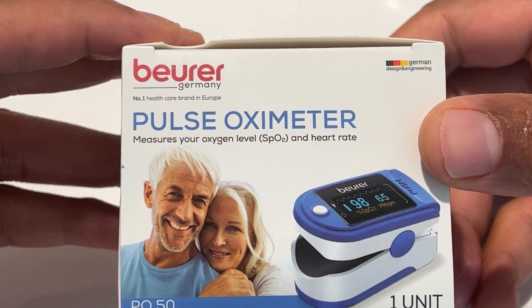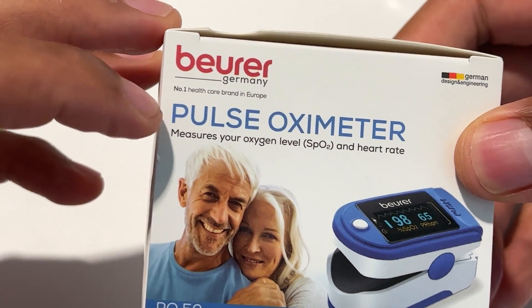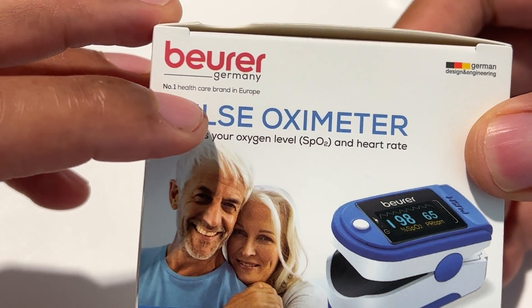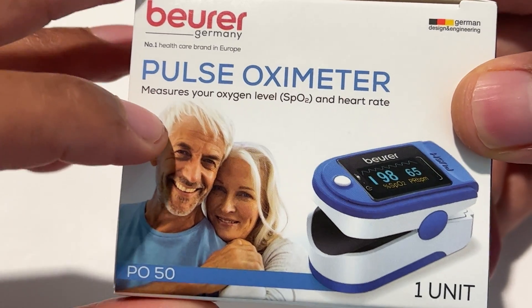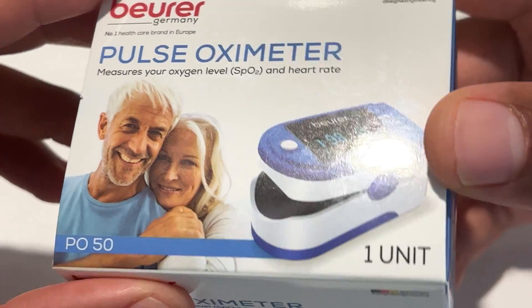I have a Beurer Pulse Oximeter that I'm going to be unboxing. This is made in Germany and it's the number one healthcare brand in Europe. It measures your oxygen levels and heart rate.